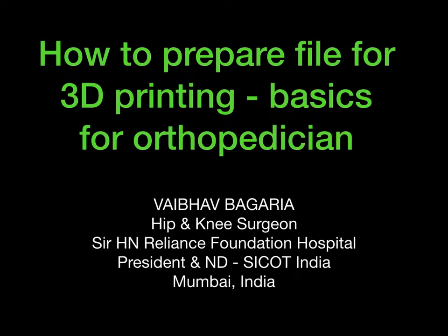Good morning, everyone. Preparing 3D printed models for surgical simulation and planning has become a vital part of orthopedics today. We use it for complex cases such as tibial condyle fracture, acetabular fractures, calcaneal fractures, spine surgeries, and also designing patient specific jigs for our knee replacements and complex trauma cases.